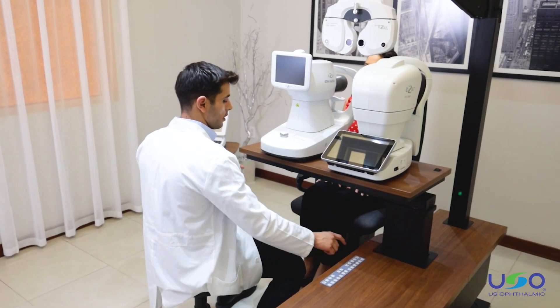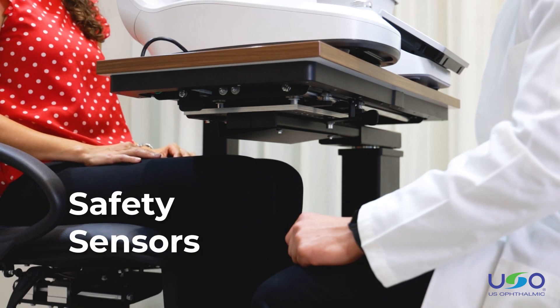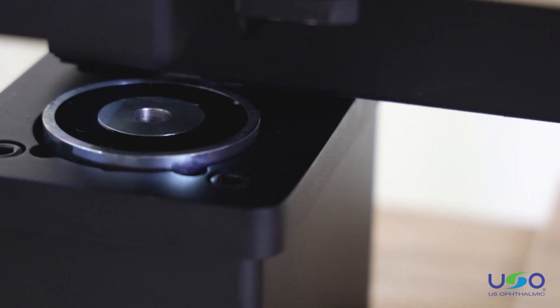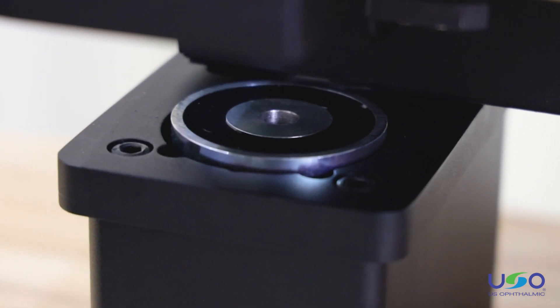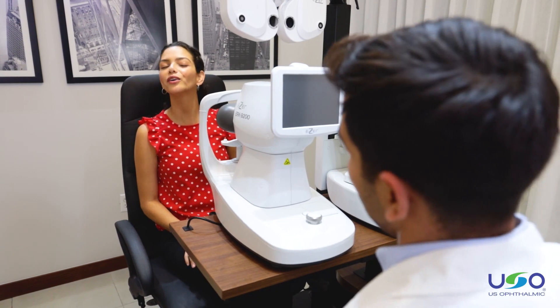The table height can be conveniently adjusted with the control panel and is equipped with safety sensors to stop if it touches a patient's legs. The table also includes a magnetic safety brake which will stop the table and lock it in position so it does not move during an exam.